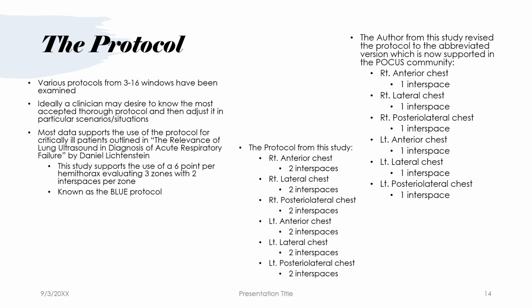So if you want to look for more data to support these protocols, you're more than welcome to find them at those wonderful resources. But I was trying to imagine in your position what's going to be most integral. What are your goals when you're doing this? And most people's goals are not to spend a lot of time assessing a patient, getting very similar information to what they would get in a very rapid exam. So I gave you a couple different options here.